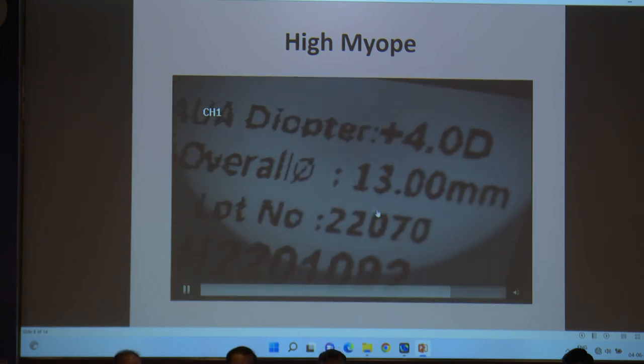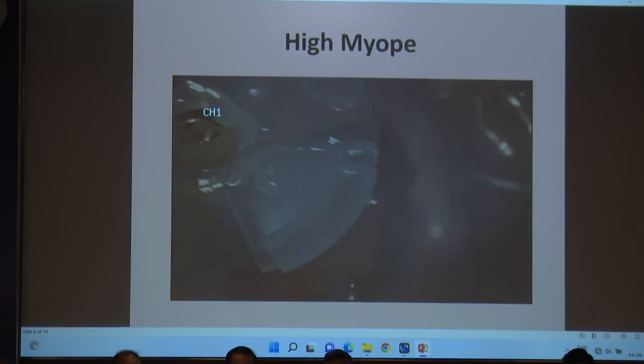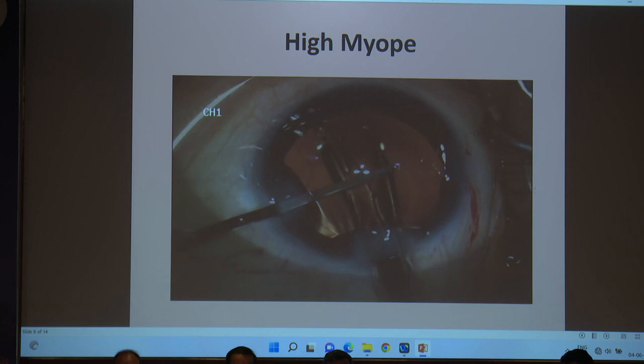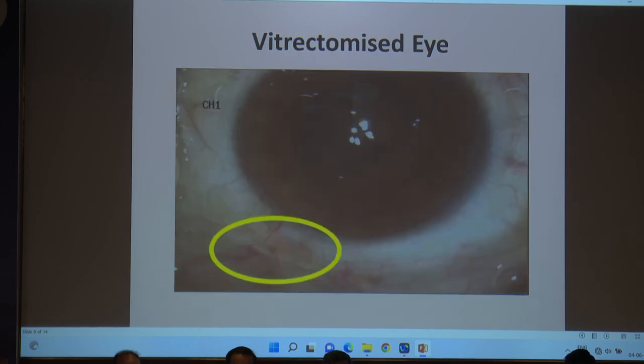This is a plus 4 diopter single piece lens. Lenses of less than 5 diopter, which were not available earlier, have also started coming into the market. So this is from OptiPlus. I have implanted it in this patient, and this is another case.